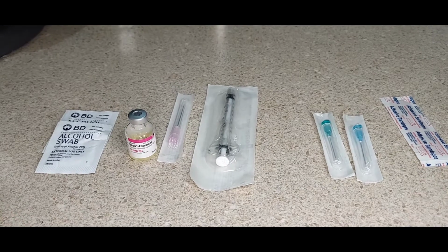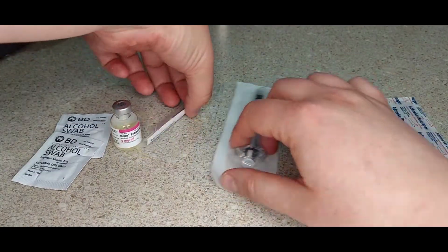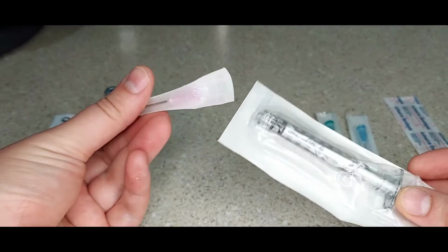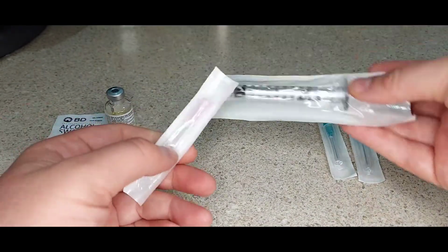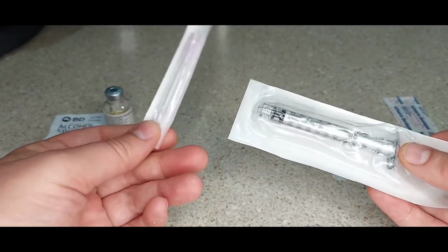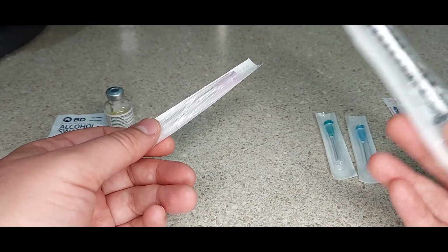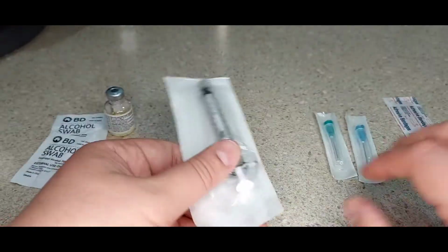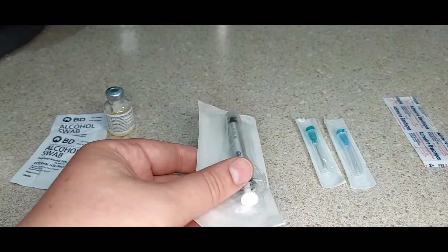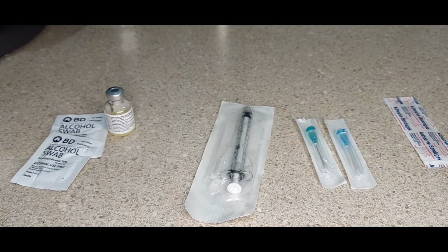Essentially, what we're going to do is we're going to open up one of these, swab this. While that dries, we're going to open this up, attach these, draw up using this pink needle to draw up the liquid into here. Discard this pink needle and use one of these skin needles, inject, and go. That is the basic way that this goes.